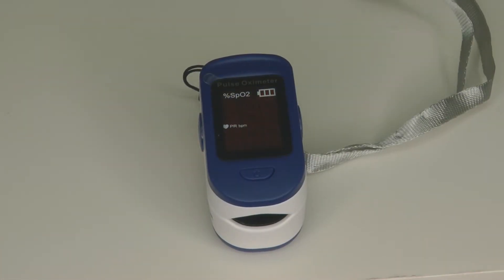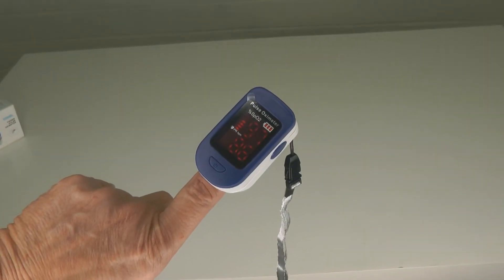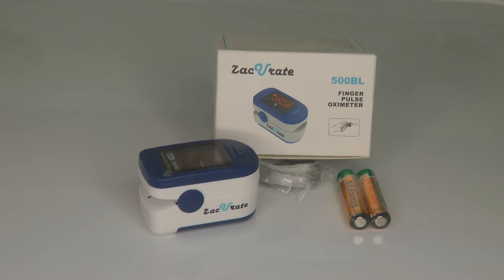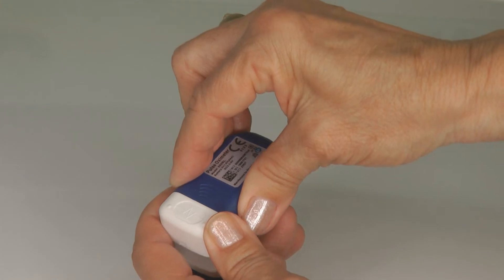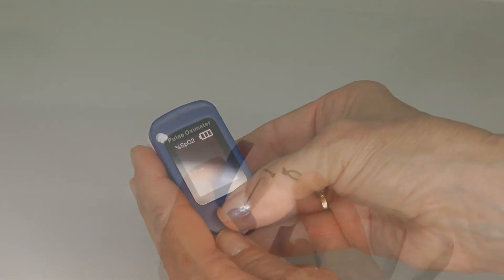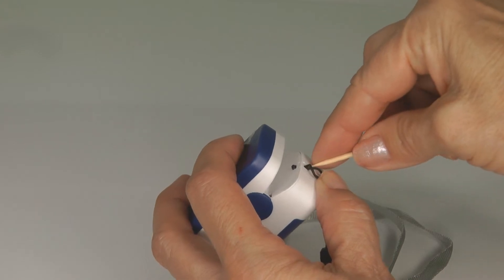SpO2 stands for peripheral capillary oxygen saturation. The top number measures the oxygen saturation of your blood, and the bottom indicator is for your pulse. It comes with triple-A batteries and a lanyard. Open the back, insert the batteries, slide the cover back on, and then insert the lanyard through the little tiny hole.